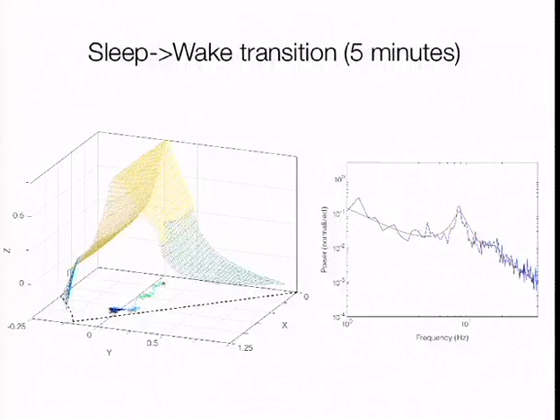So we're able to recover pretty much all of the key aspects of that schematic diagram that I showed at the start. We know where our stability boundary is between the healthy states and the seizure states. We know where the traditional sleep stages are, and we can look at an EEG and estimate the trajectory that an individual's brain state has taken.